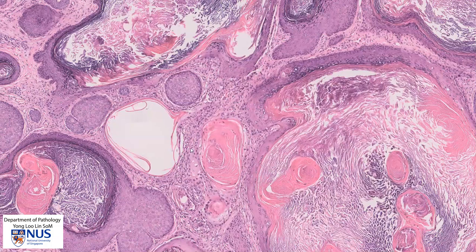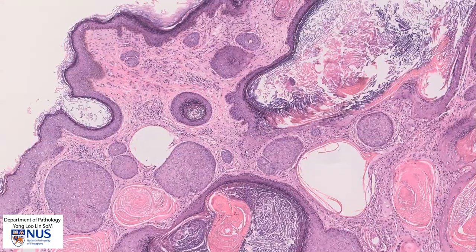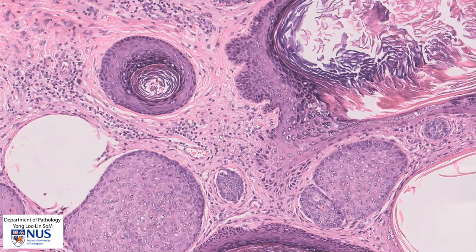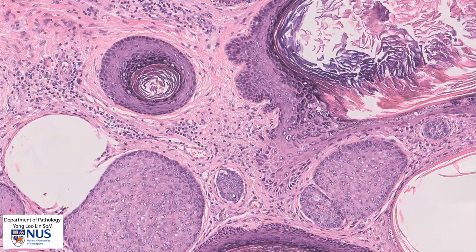We can also appreciate that the stroma around these nests or islands of infiltrating squamous cells appears to be quite cellular and quite disturbed. There are more inflammatory cells and also spindled myofibroblasts in the stroma, and this is evidence of stromal desmoplasia. Desmoplasia is often seen accompanying invasive epithelial tumors.